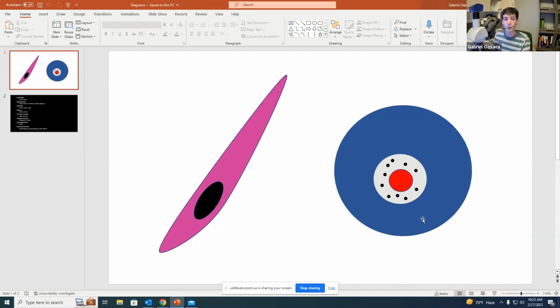So other important things to keep in your mind in terms of descriptions, you could see that this particular nucleus is completely blacked out, very dense, if you will. So this would be hyperchromatic. And then over here, our nucleus is more like a bag with a bunch of little chromatin dots in it. So this would be a vesicular chromatin, vesicular meaning like a bag. And then in this particular case, we can also see a very prominent nucleolus. So this would be a macronucleolus, and in this case, it's cherry red, which is a buzzword for melanoma, should you ever hear that particular descriptor.